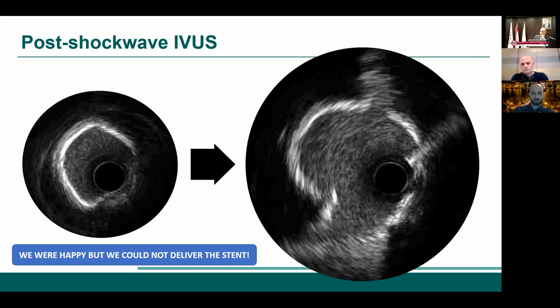And we thought, at least by the tactile sensation and the feedback we were getting, that potentially there was a crack in that calcium. But clearly there was some nodule of calcium or something protruding into that lumen, hitting that, because of course, it was after trying all these tricks we try every now and then. You have a guideliner, lift the guide a bit, then pull and push, and you rail it a bit, trying to get away from that nodule.